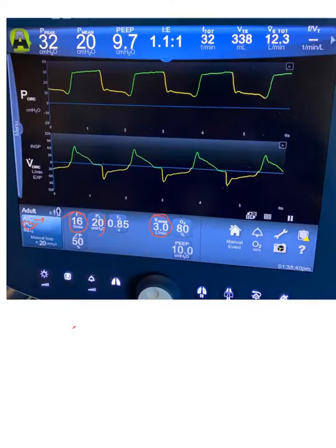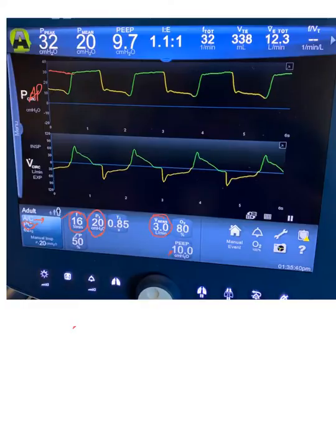Now, the target is pressure-time based. We tell the ventilator to keep the proximal airway pressure during inspiration at 20 cmH2O — you can see it right here at 20. It reads 30 on screen simply because the 20 starts at a baseline of 10 PEEP, and the ventilator fulfills this requirement. That is the pressure target.